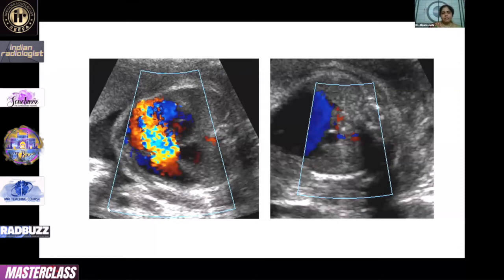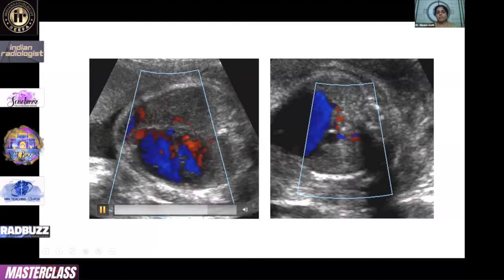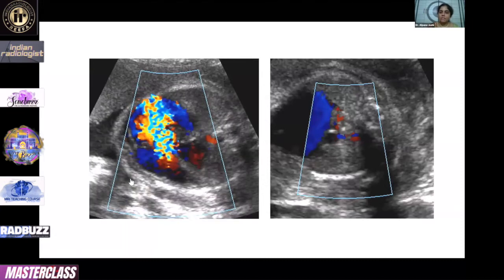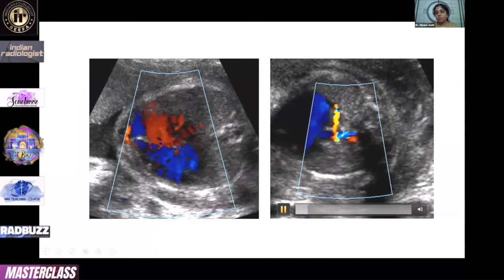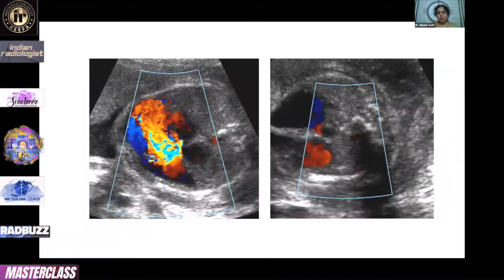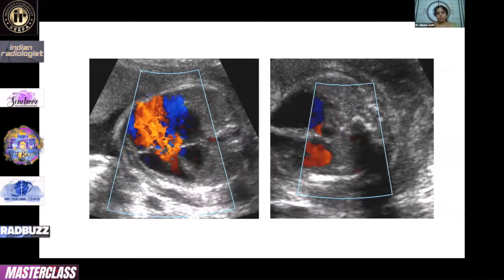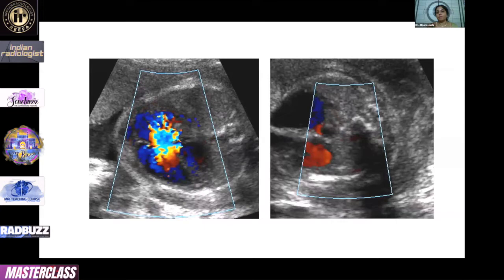Then again, there are some conditions where you're not very sure. The hen first or the egg first kind of an approach. There is a very severe tricuspid regurgitation. There was no Epstein's anomaly, but if you look at the outflow tracts, there was the retrograde flow through the ductus, and there was no communication of the pulmonary artery with the right ventricle. This is again about 10 years back. I was closely associated with one senior pediatric cardiologist whom I used to always consult for an opinion. Even she felt that this was pulmonary atresia.